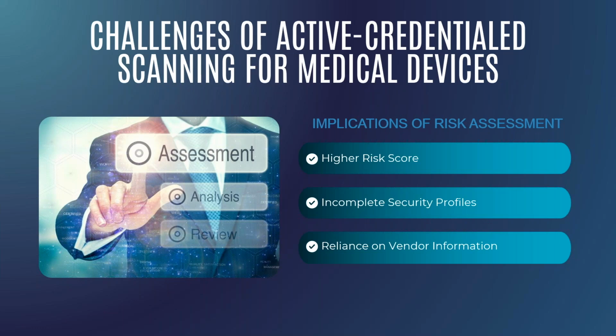But you also have to explain to IT, or whoever you're working with when you're evaluating the risk of the assessment and bringing it into your hospital: okay, the reason we can't do active scanning is because it's going to take down our system, or it's not compliant with the medical system, or it's going to affect the compatibility of the system itself. The vendors will provide you that information, but then you have to understand how we're going to do this. How often are we passive scanning, if that's the case, just to make sure you're more secure? Okay, next slide.